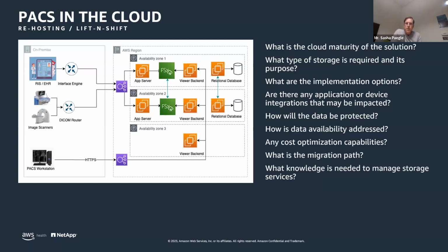If we switched temporarily and thought, hey, my use case is really a disaster recovery use case, then if you understand how availability zones relate to each other, you may discover, working with your cloud provider, that you can do a disaster recovery use case by backing up or archiving images to just a single availability zone. So I highly encourage diving into that, because it makes you pause to think: how easy is this going to be to manage? Is this a way to cost optimize in terms of how much storage we use?